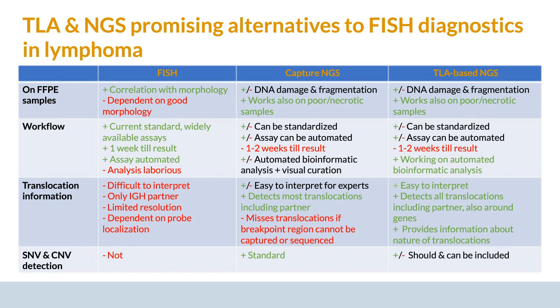With capture NGS we have this already. We have copy numbers, translocations, mutations, and for TLA, well, there's basically nothing to hold us back to also include capture probes for mutations and make genome-wide capture probes for copy numbers. And yeah, thank you very much.